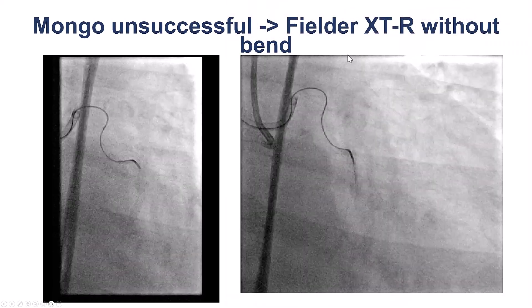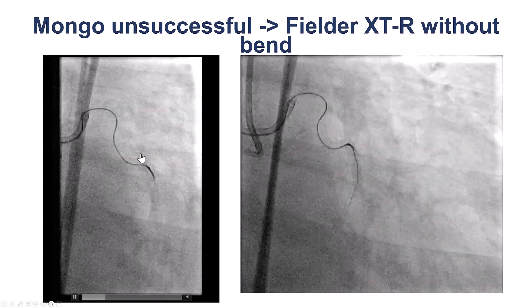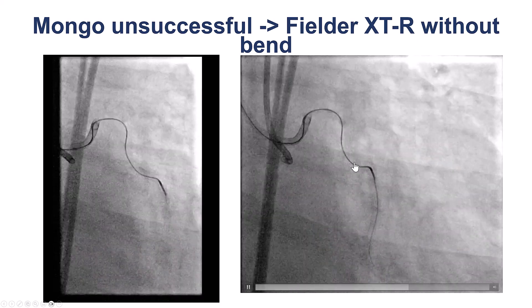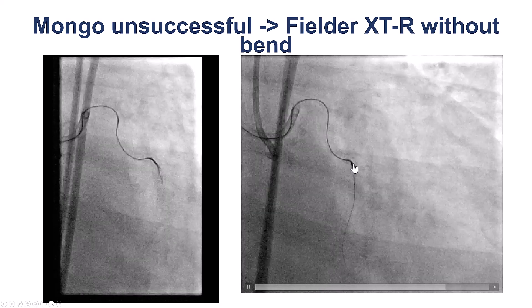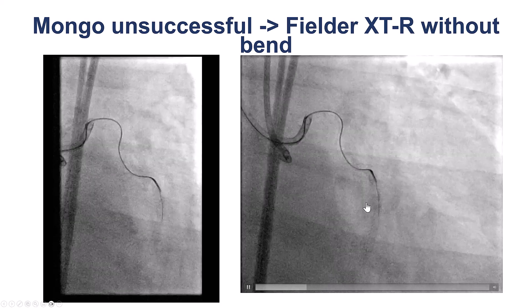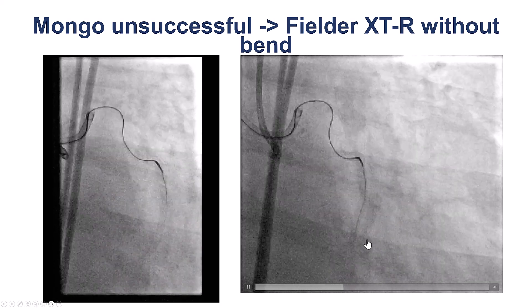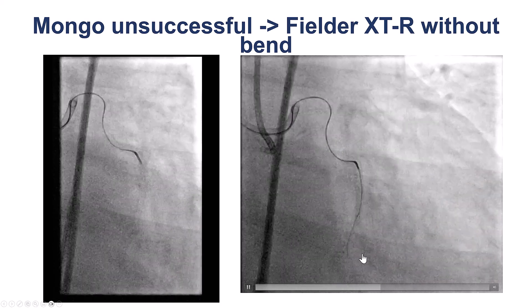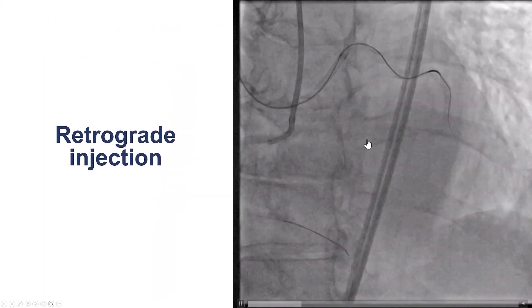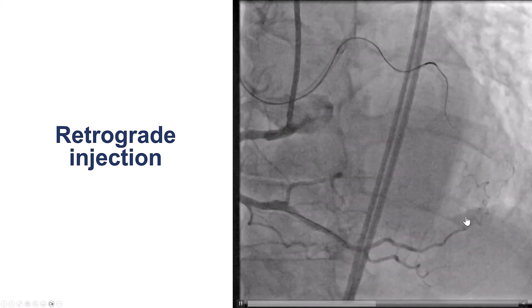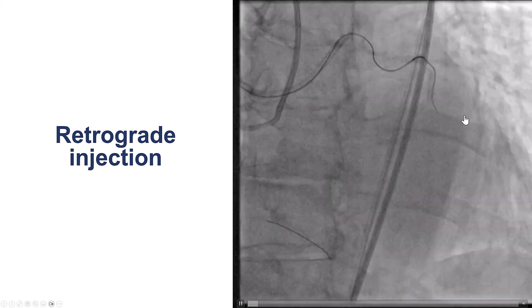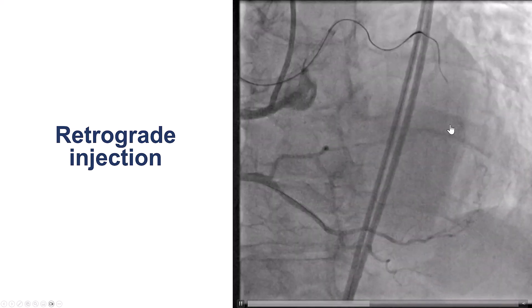However, when we then took a polymer-jacketed wire — the Mongo didn't go, but a Fielder XTR, which is a soft tapered polymer-jacketed guidewire — it nicely tracked along the previously placed circumflex stents and seemed to enter into the second obtuse marginal branch. On the contralateral injection, again with a lot of tortuosity, the wire appears to be in that second obtuse marginal branch.